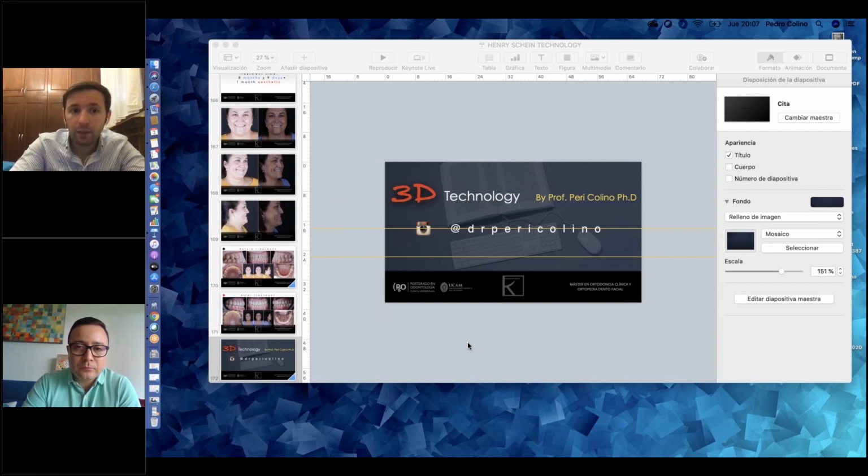The force 1 is 1/4 inch of distance and 6.5 ounces of force. And the force 2 is 3/16 inch of distance and 8.5 ounces of force. So first month, force 1, second month, until I correct the class 2, force 2.